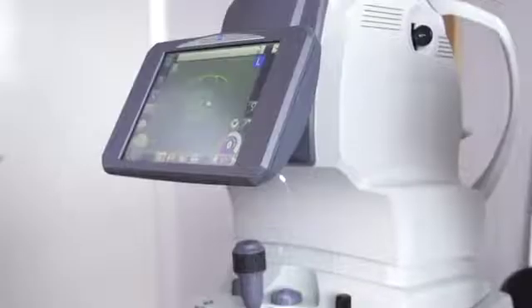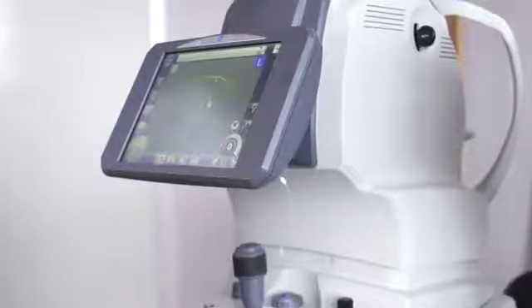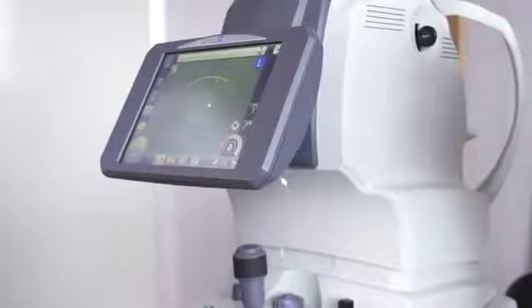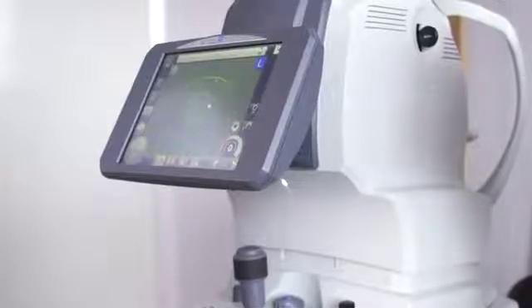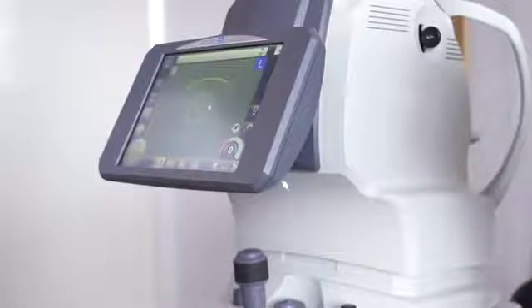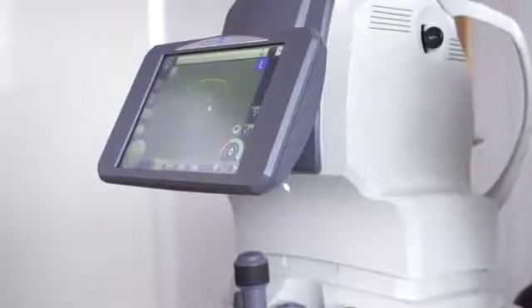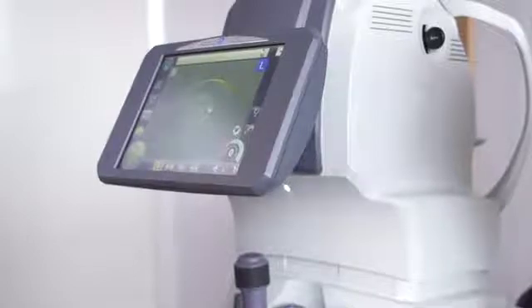The AFC330 is NIDEK's fully automated, non-mydriatic fundus camera. The integrated 12 megapixel camera and computer in one compact device allow the capture of high quality images in a simple, easy to use automated process.